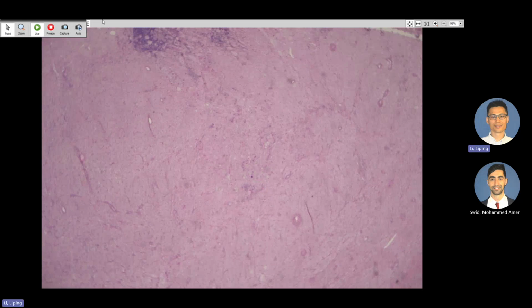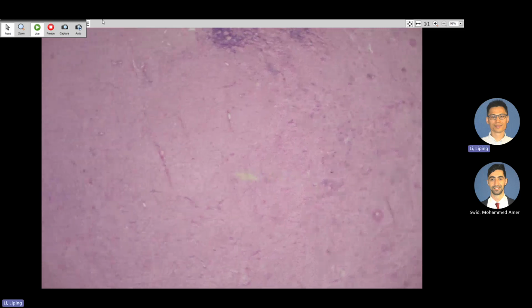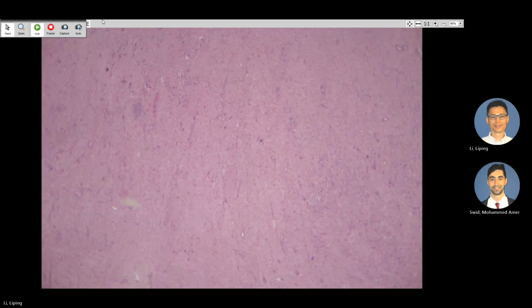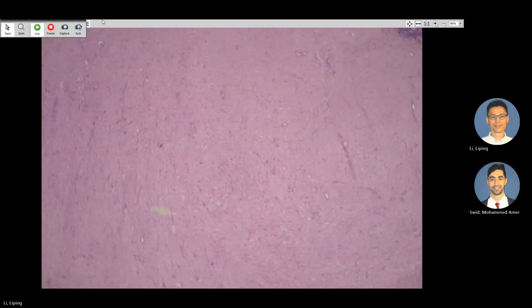And then what about this? What do you think of this bluish cell aggregation? The neuroblast. More here. And then of course we have our friend, ganglion cells. So we have more than 50% of this Schwannian stroma, ganglion cells, ganglioneuroma.